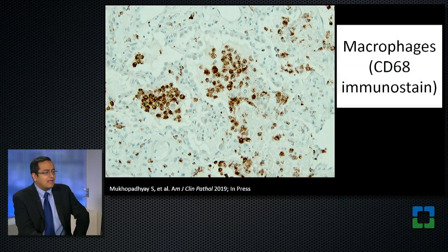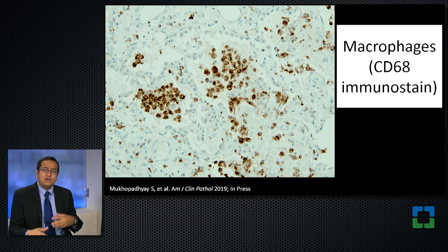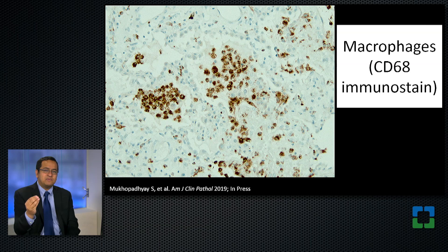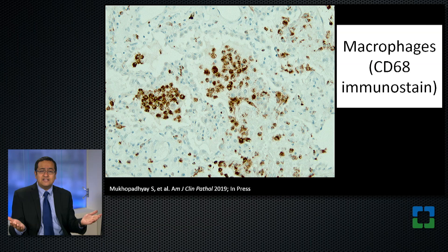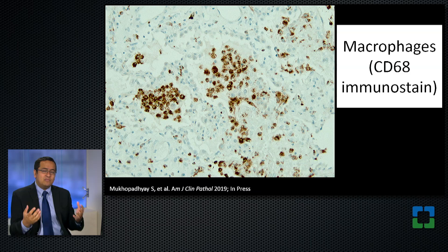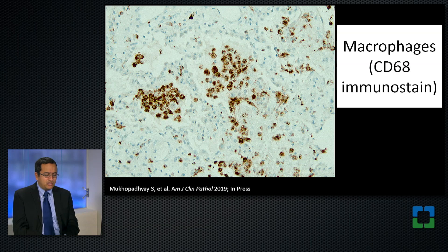That is one major finding that's going to be a center of debate in coming days. Here's another way to look at macrophages — an immunohistochemical stain for CD68, a marker present on macrophages. Everything that's brown is a macrophage. Clearly there are a lot of macrophages in these lungs, increased in some cases. Some of them have lipid and look foamy, but they do not have features of exogenous lipoid pneumonia.